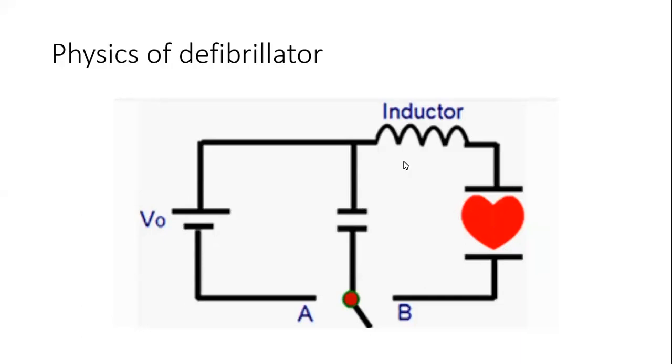So that is why the part I was talking about is important: you must press the right button. Are you going to synchronize or are you going to just defibrillate? Because the machine itself will not detect what is happening. You're the one who needs to direct it, whether it's going to synchronize or defibrillate, because all it's going to do is deliver energy.